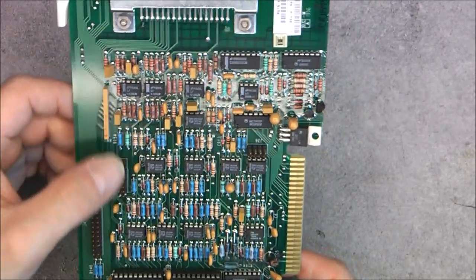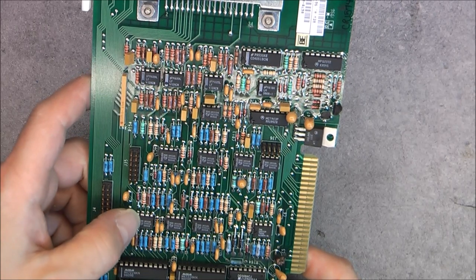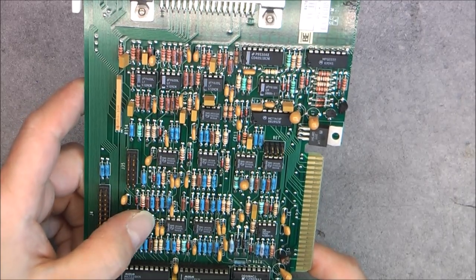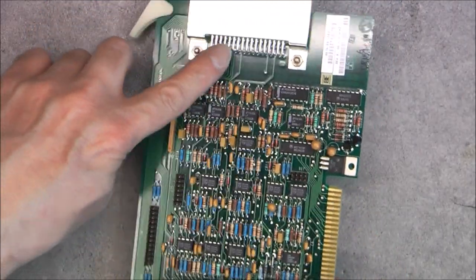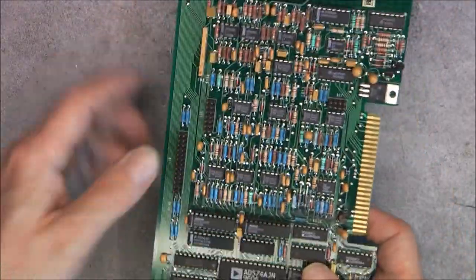And here apparently more analog front-end. It seems, yes, LM358, so it must be op amps, a lot of them. And you can see, yes, the EEPROM slot here. All the tracks are going here directly without passing through this area.